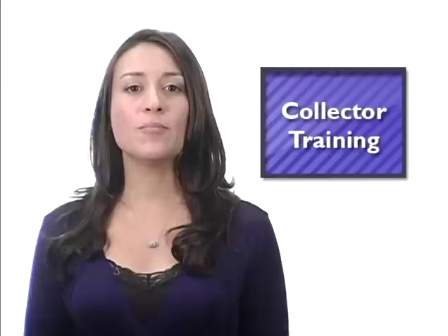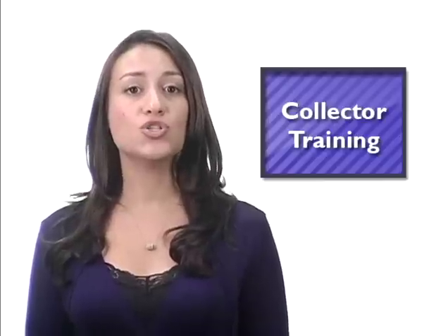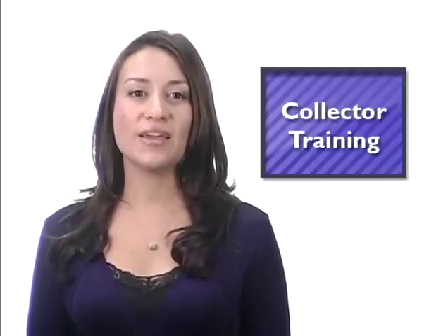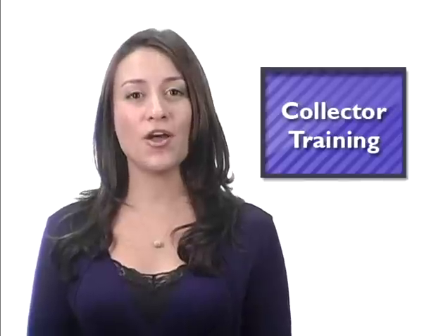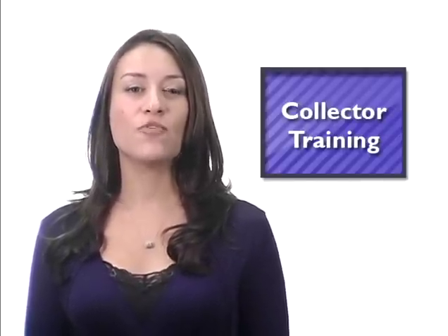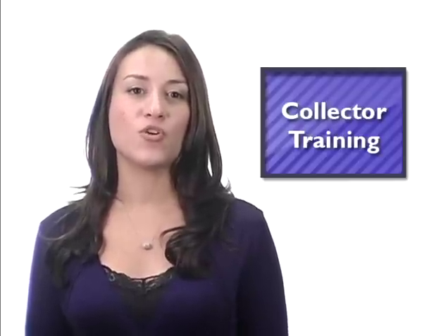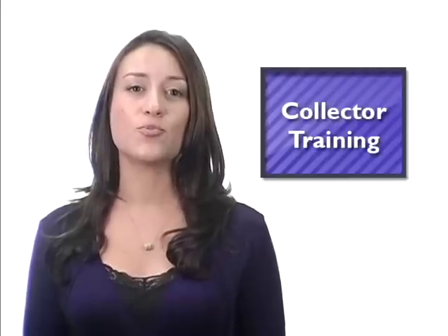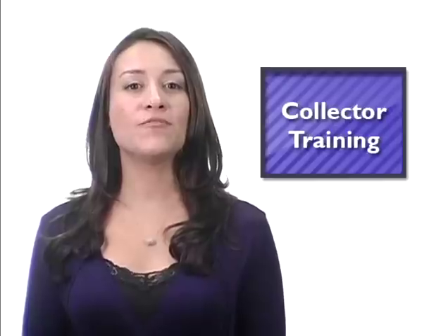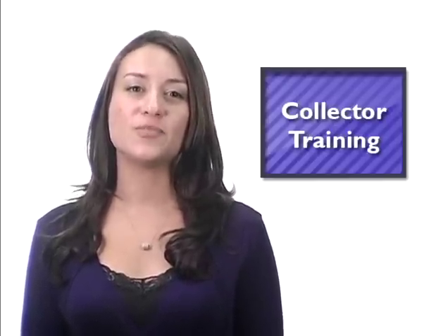Specifically, the observer must ask the donor to raise his or her shirt, blouse, skirt, and/or dress above the navel, and lower pants and/or shorts and underpants to mid-thigh. With the applicable clothing raised and lowered, the donor must turn around to show the observer that he or she is not concealing a prosthetic device. After the check, the donor may return his or her clothing to the proper position to provide the specimen.